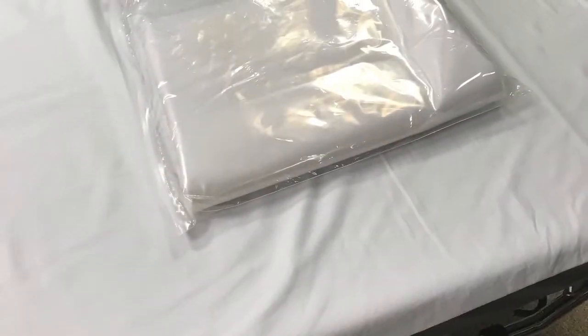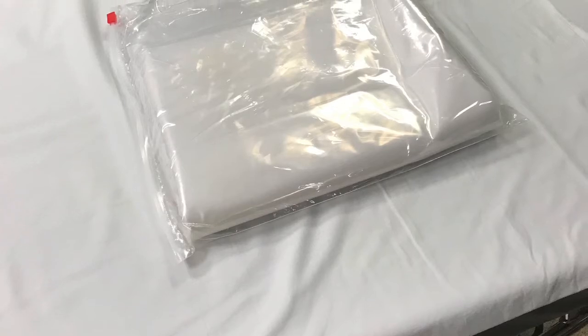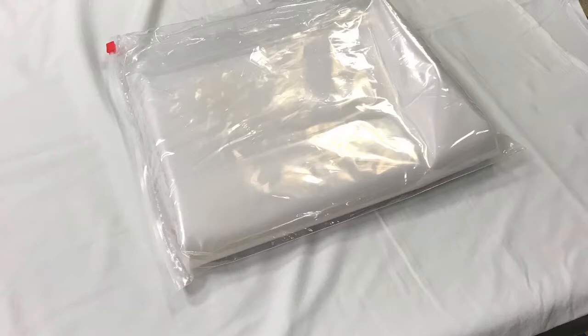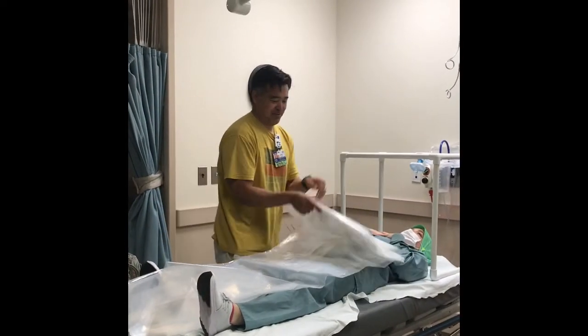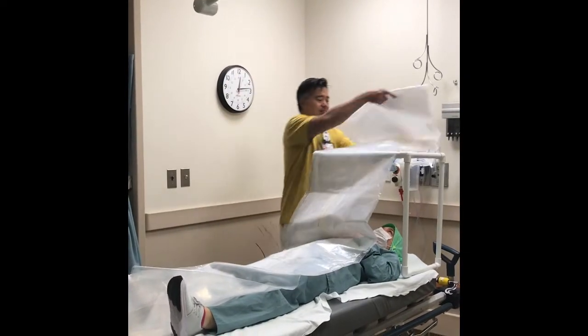With the patient in the bed, place the drape at the foot and open it towards the head over the top of the NPE as demonstrated here. It is important to open the drape in this fashion so that the holes used for the intubator and respiratory therapy line up properly.